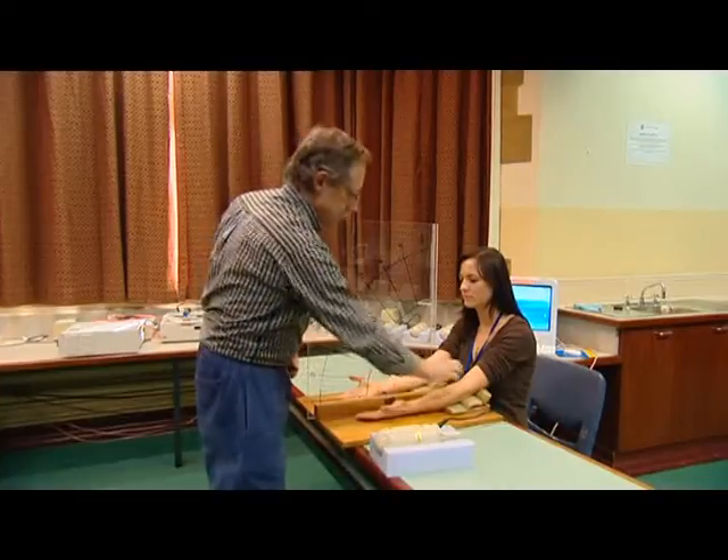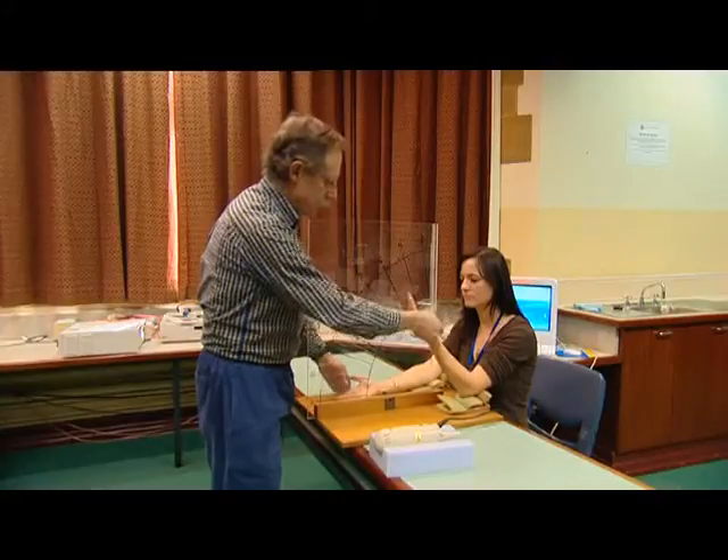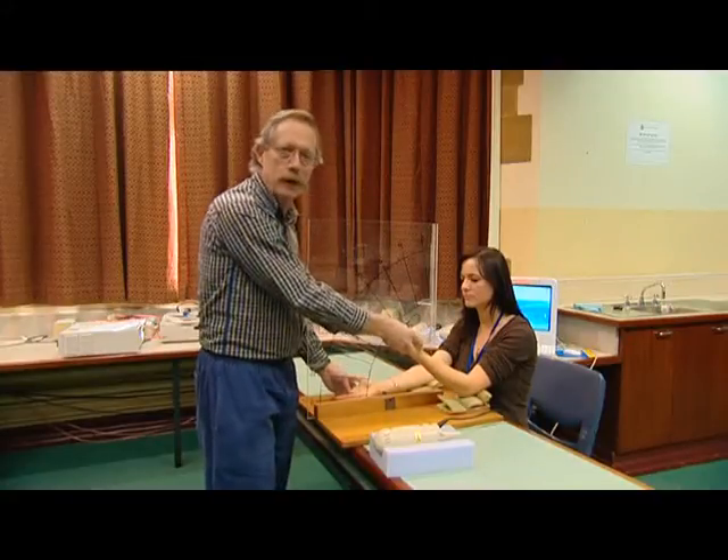You could see that while I was stimulating the tendon, her arm came right up to this angle, but when I removed it, it came down and matched the angle of the other arm.